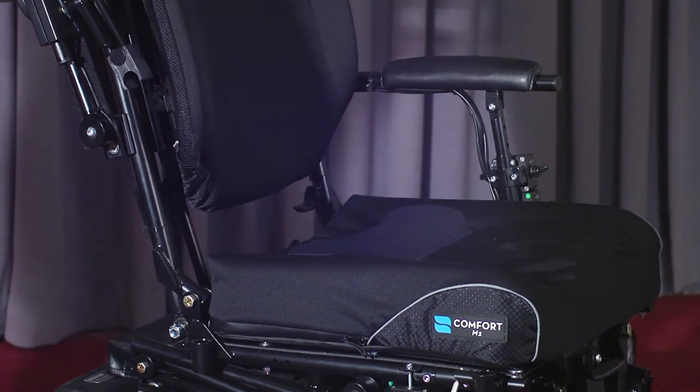It's really finding what are the functional abilities, what is the type of movement, how do you transfer, how do you get in and out of your car, what's life like in your home, in order to come up with the right product that hopefully will meet all those needs. Some of the most important things that a consumer should think about is, first off, to think about the function and the performance of the product and how it's going to help them gain access to their environment.